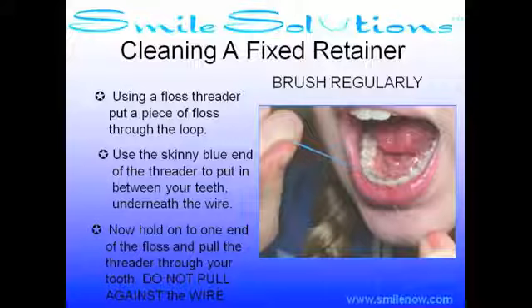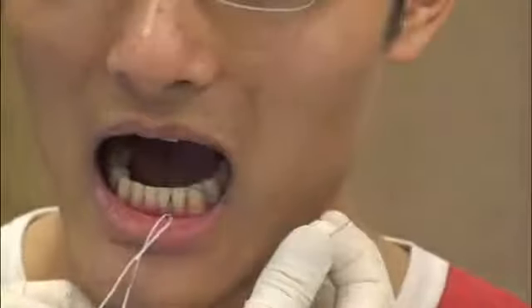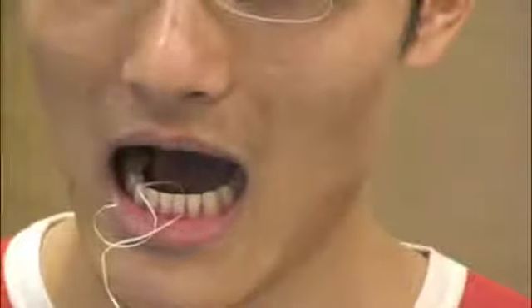Cleaning your fixed retainer: Use the floss threader and place a piece of floss through the loop. Thread the floss threader underneath the contact between your teeth and the retainer wire. Pull the threader between the teeth while holding on to one end of the floss. Pull the rest of the floss through. Now you can floss up and down between your teeth, being careful not to put too much pressure on the retainer wire.